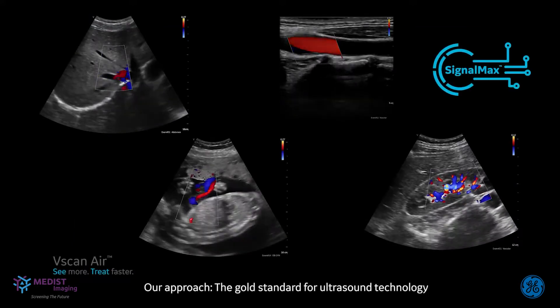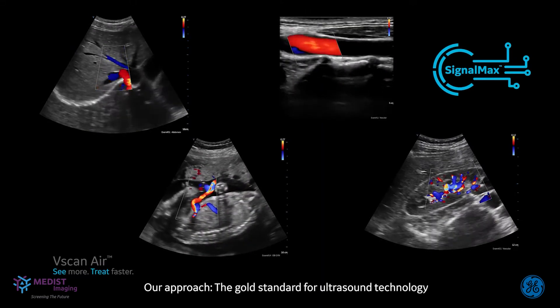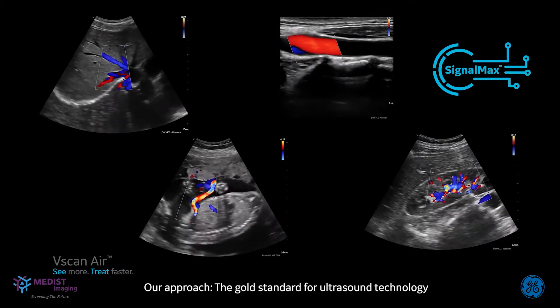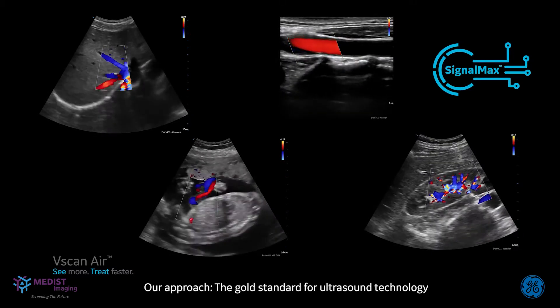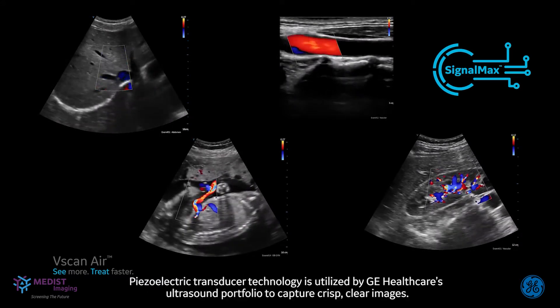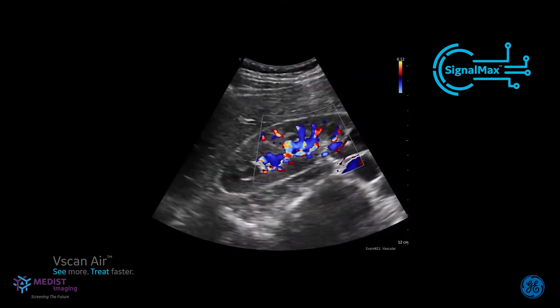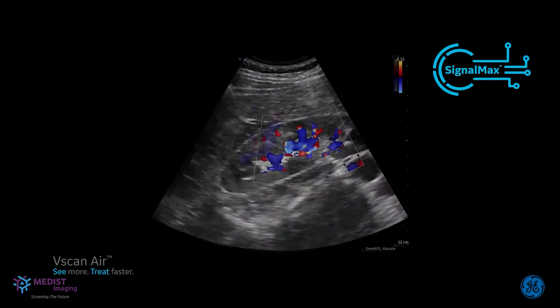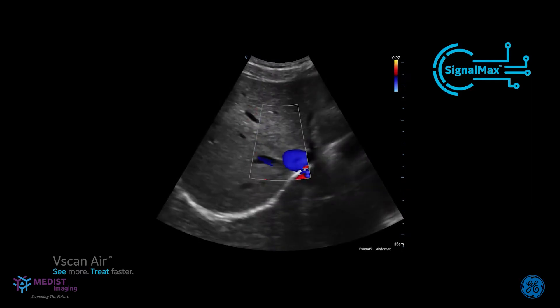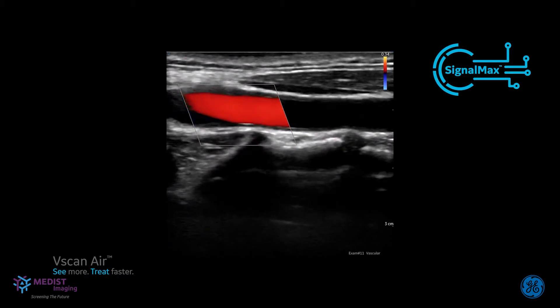V-Scan Air delivers clear images to support early diagnosis and help you monitor treatments. It is powered by our SignalMax technology, which makes it possible to deliver crystal-clear images and the power of a high-performance ultrasound machine within a small, lightweight, and wireless dual probe that comfortably fits in the palm of your hand. A clear image enables you to easily see structures inside your patient's body to enable accurate diagnosis and treatment decisions at the point of care, potentially resulting in fewer and shorter visits for your patients.